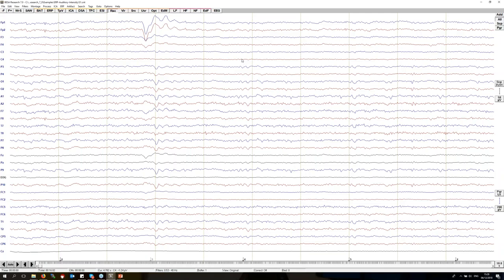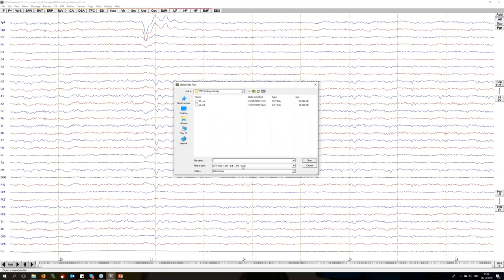And using these priors, we then sample the posterior distribution and we use Bayes' theorem to figure out the likelihood for different values of these three parameters given the observed data. So that's the theory. In practice, we have an issue there. And this is about sampling of this posterior distribution because it takes a long time. And here the Markov chain Monte Carlo sampling comes in handy. So we're going to look at the same data just averaged over several subjects.